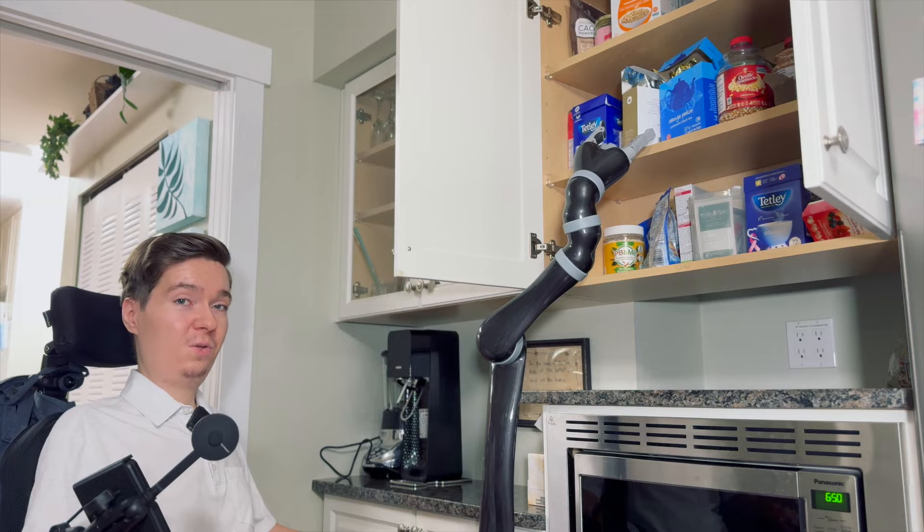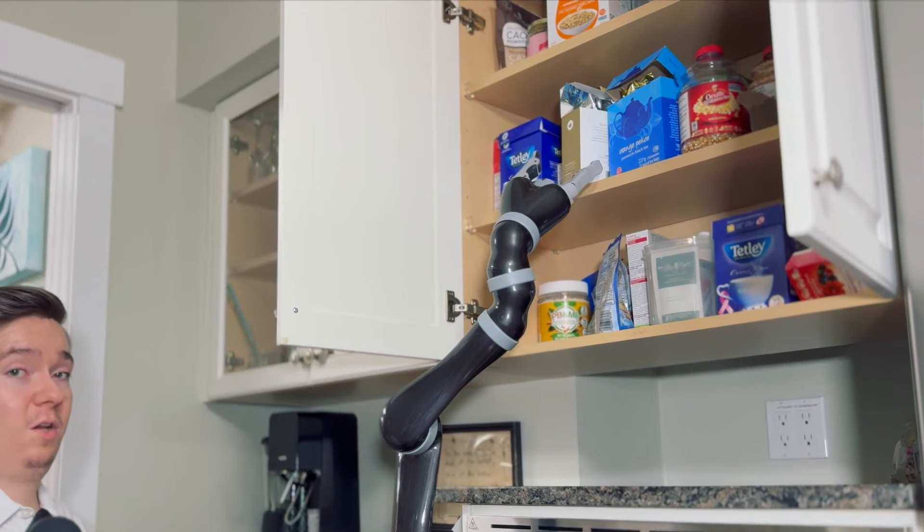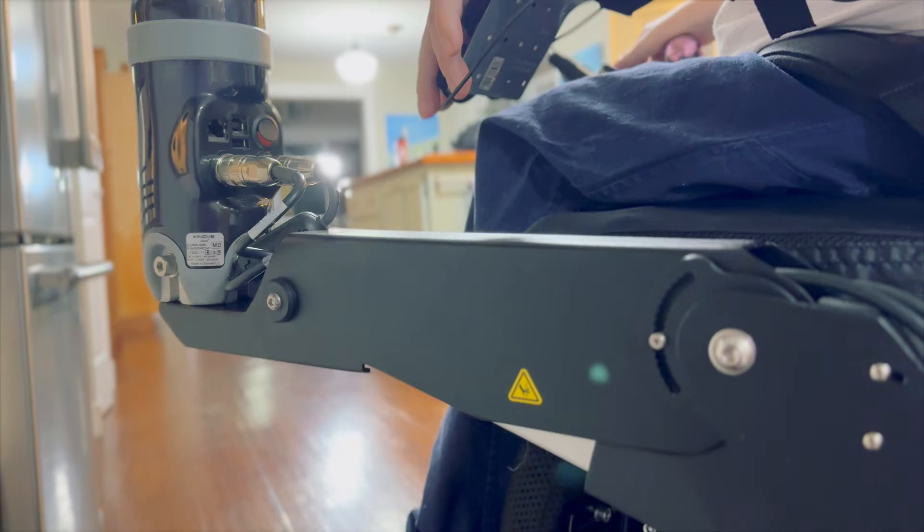Unfortunately, even with Jayco's 90 centimeter reach, oftentimes the world just isn't built for us in our seated position. Thankfully, even when something like this box of tea up here is out of my reach, with the lift arm I can raise Jayco up to reach even greater heights.